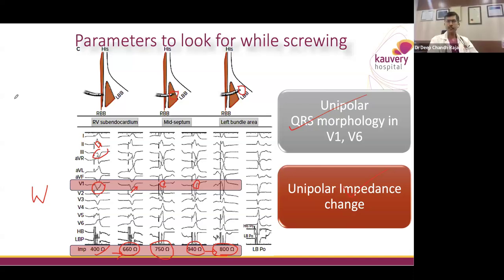Thank you for that question, Deepak. It's not uncommon to perforate the interventricular septum even after having done so many cases. You would as well allude to what I say, that we do tend to get past the interventricular septum a lot of times, and the lead freely moves within the left ventricular cavity, much to our dismay.